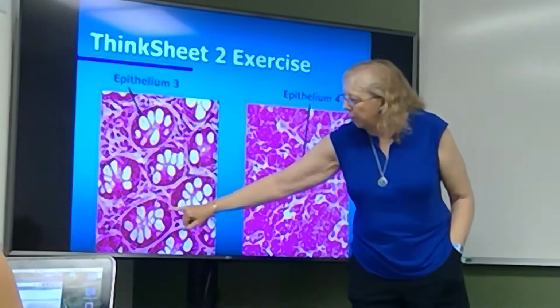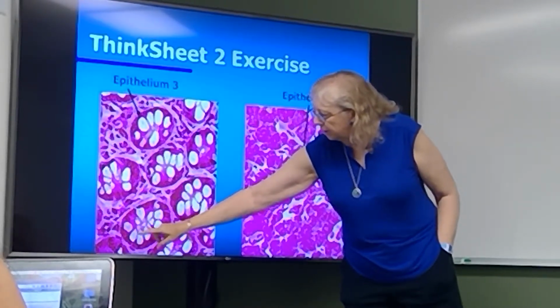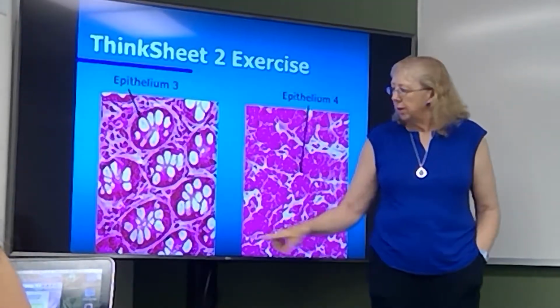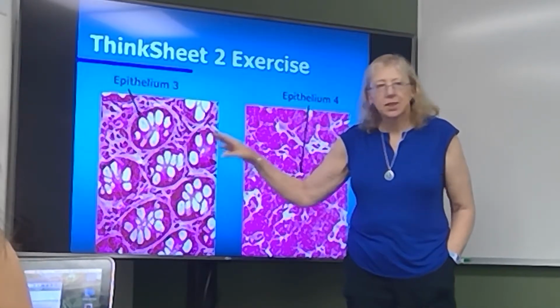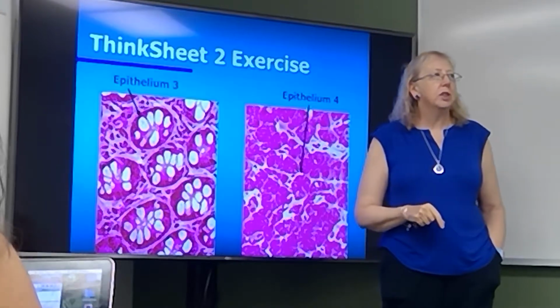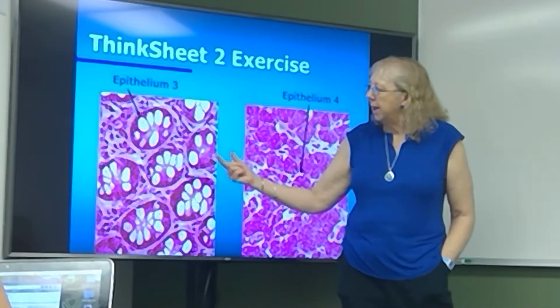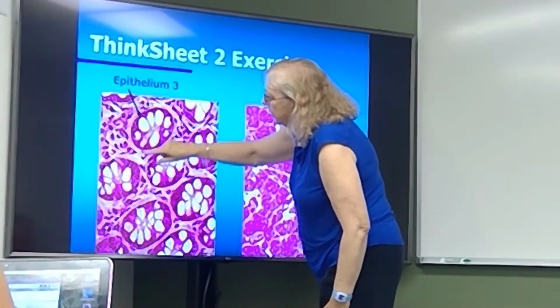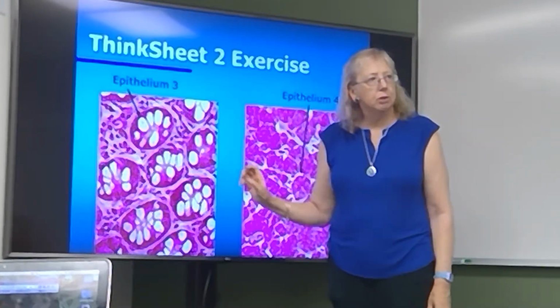So here we have cells that have, apparently, the apical part of the cell full of small little clear to frothy bits of material. Anybody think what these cells might be? Adipose? No, I know it looks clear, like an adipose cell cytoplasm might be, but it's really got this kind of frothy secretion in it, which is mucus. So these are the goblet cells. And what we're looking at here, the bases, so your villi are coming up and you cut across way deep down in here where you've got connective tissue surrounding the bases of these crypts of Lieberkühn.